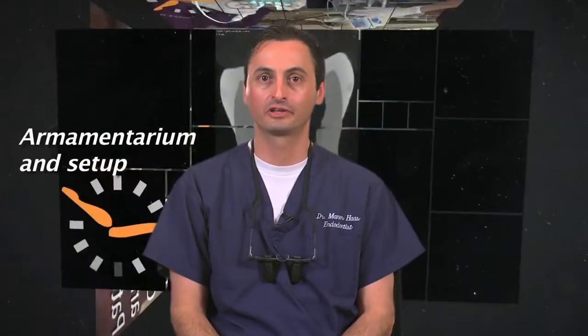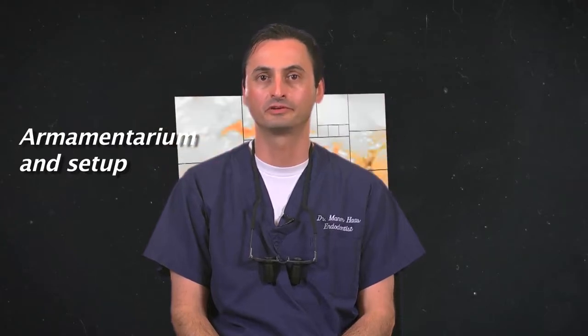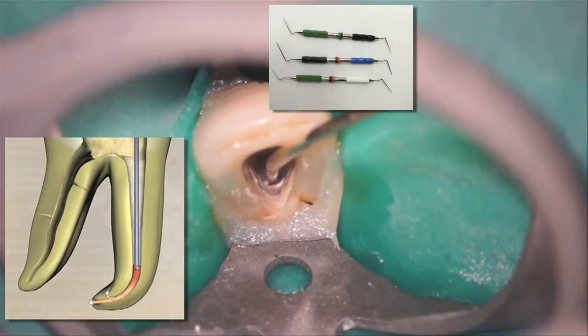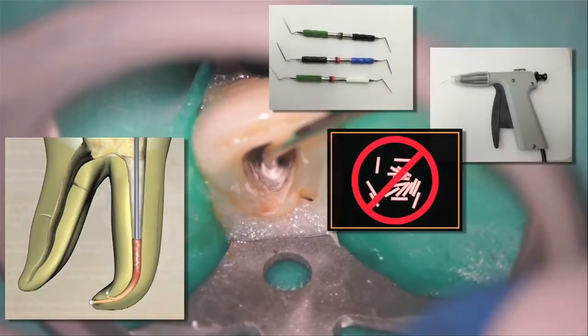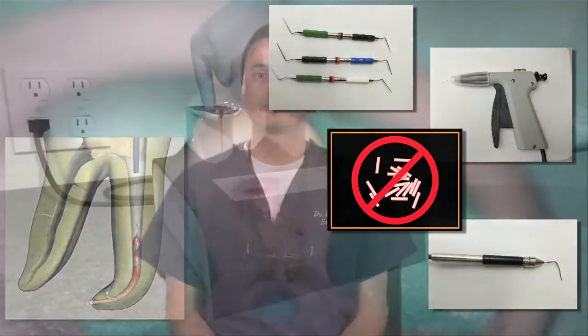A final misconception I'd like to discuss is that gutta core requires extensive setup and armamentarium. This is actually quite the opposite. For traditional warm vertical obturation you need: a master gutta percha cone, multiple pluggers, a warm obturation delivery unit with gutta percha pellets or carpules, and hot tip instruments. Compare this with what is needed for gutta core obturation: an oven, a gutta core cone, and a cotton plier. That's it.